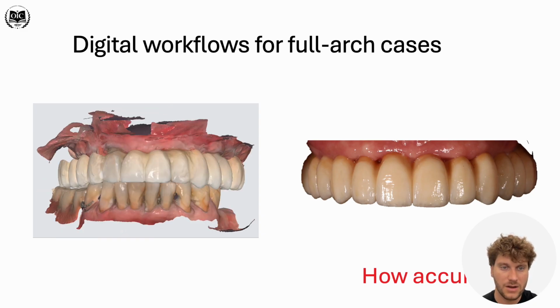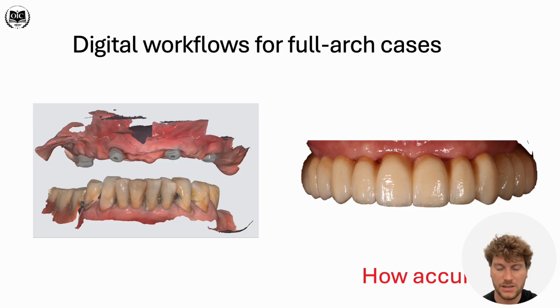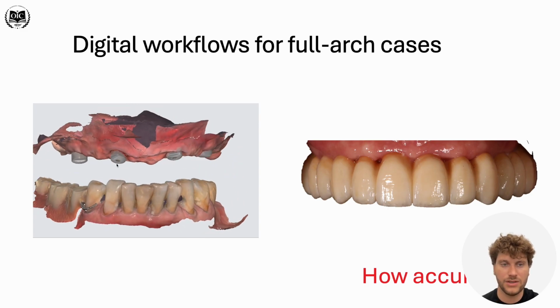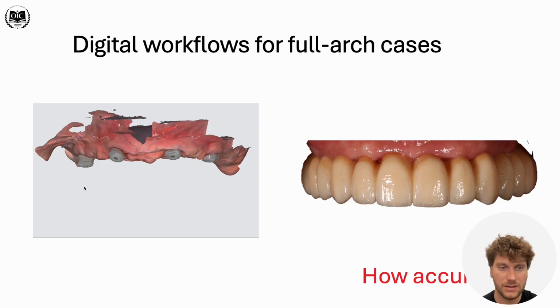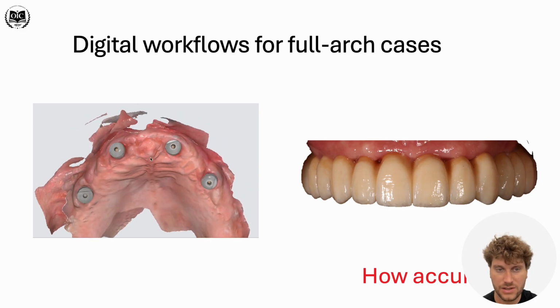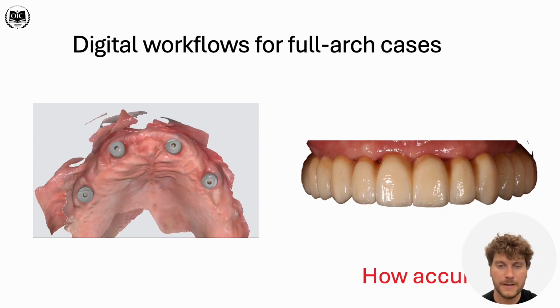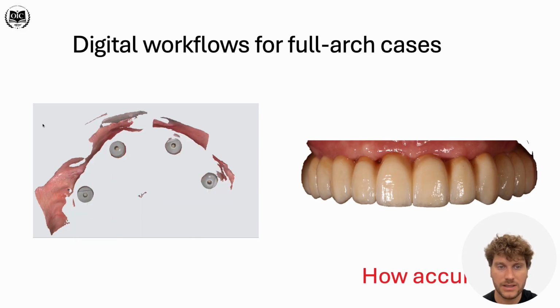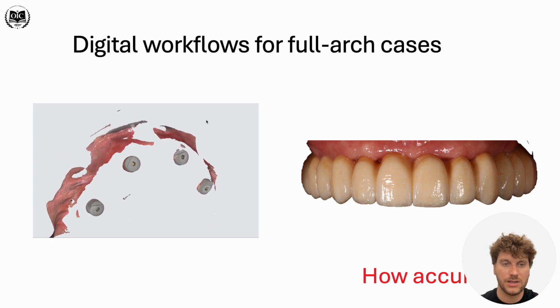But regarding these complicated cases of full arch extensive restorations, there's still lots of hesitance from clinical practitioners, and in the research field, the number of publications is quite large, so it indicates that there are some pain points and accuracy debates on how well we can trust these technologies in producing these kinds of restorations on implants.